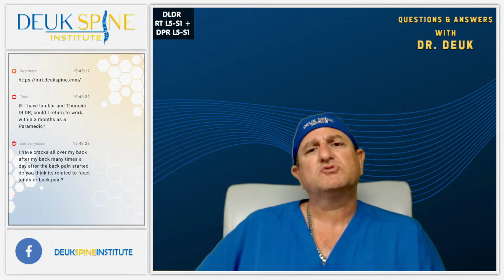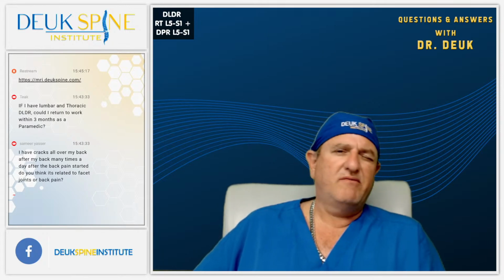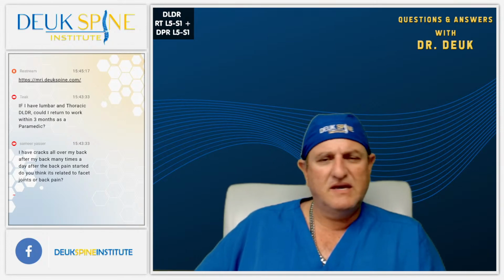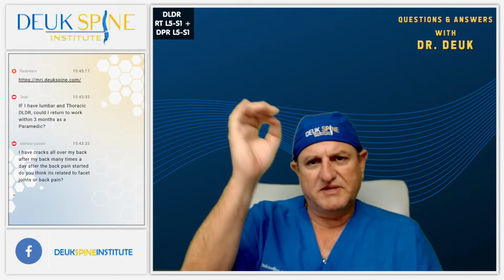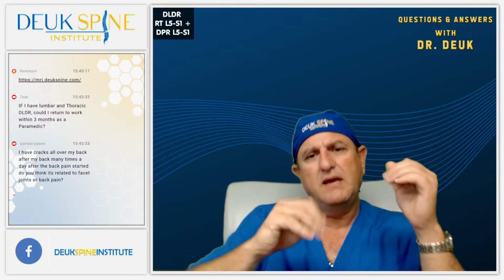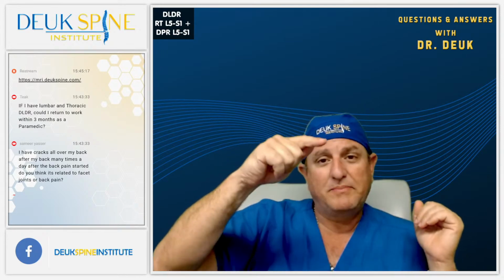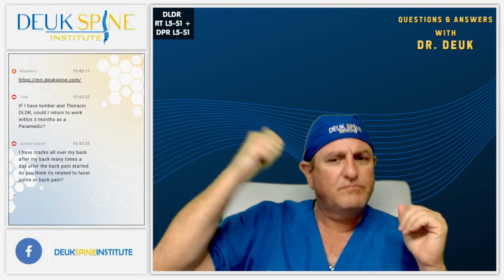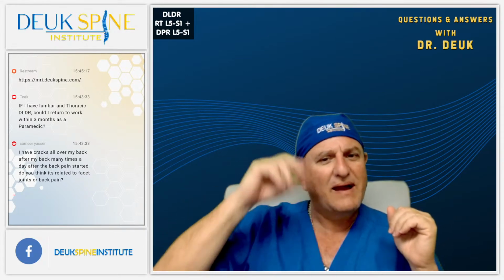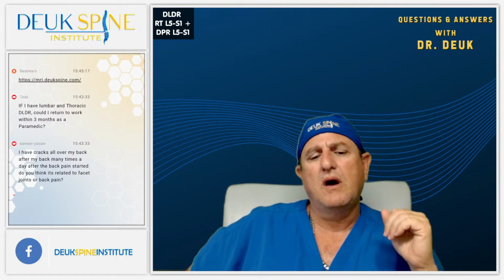We're going to go in and fix 3 discs. I think it's number 6, 7, like 8, 9, 9, 10. Anyway, we'll have that answer for you shortly. We're going to place 3 needles, 1, 2, 3. And she's amazing because she's like, here's my pain, here's my pain, here's my pain. I literally put in like 4 X's on her back right where her pain is, and that lines up with these herniations. So I believe her.